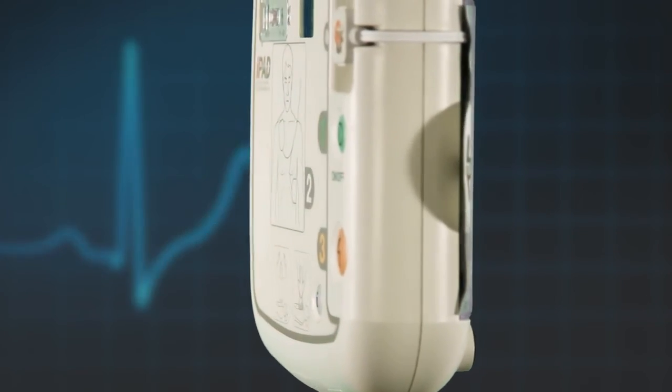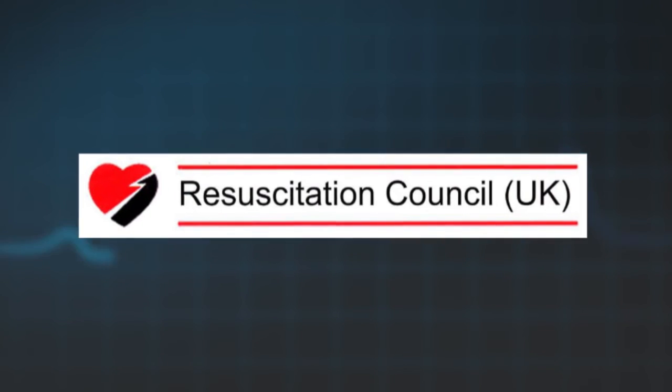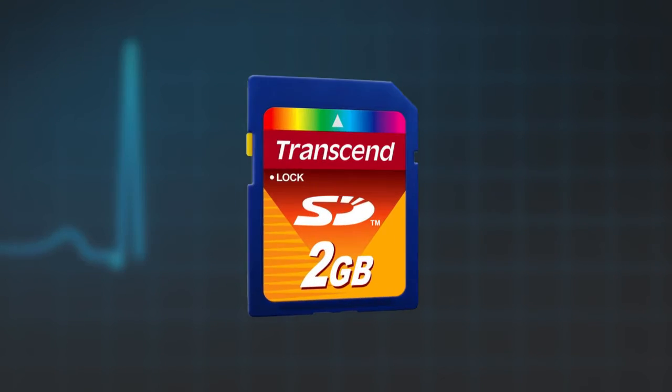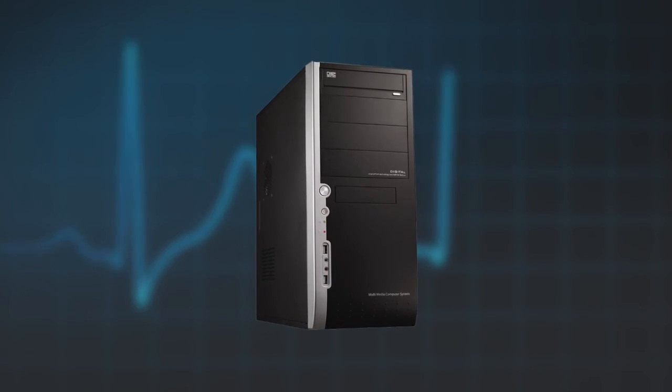Finally, the iPad SP1 AED can be upgraded should your local resuscitation guidelines and protocols change in the future. Some upgrades can be done via the SD card and others can be done via the connection of the AED to a computer.